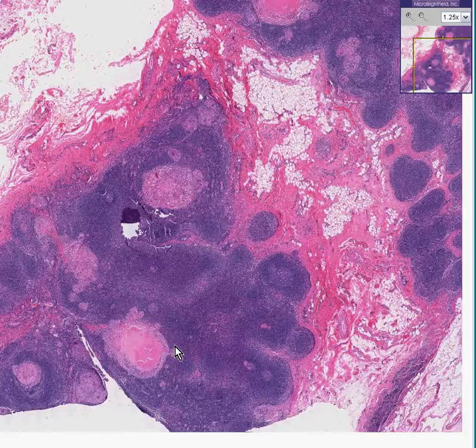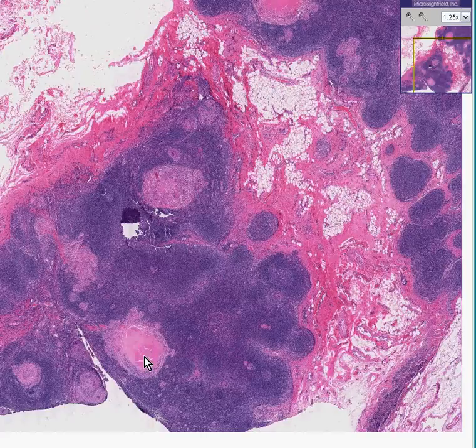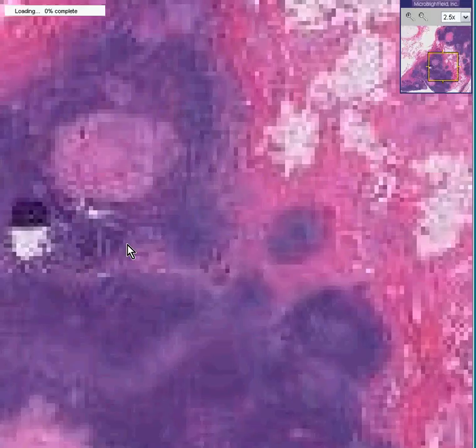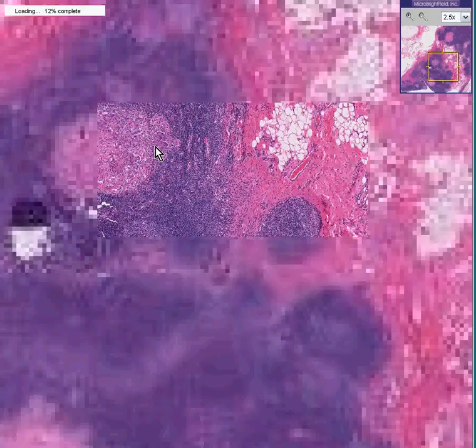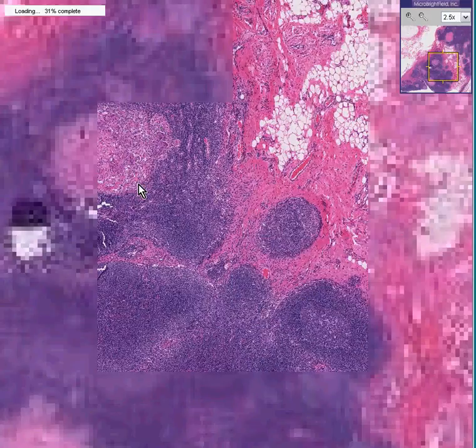You can see that there are certain areas which are extremely well differentiated, extremely pink, and also centrally necrotic in this area. These are granulomas. This is a granulomatous inflammation of a lymph node.